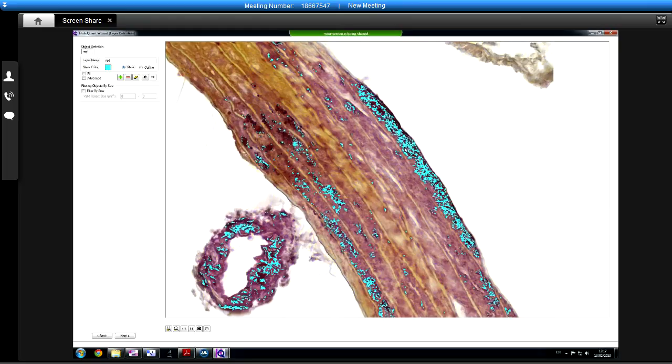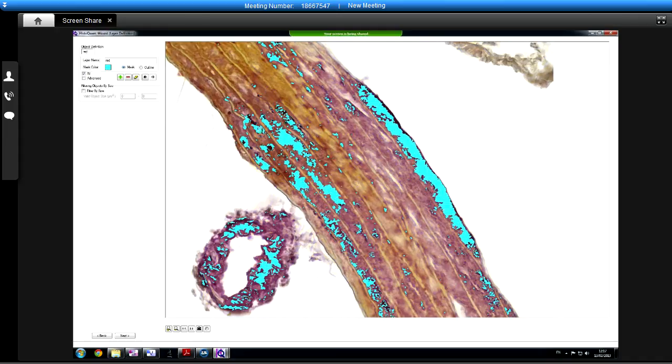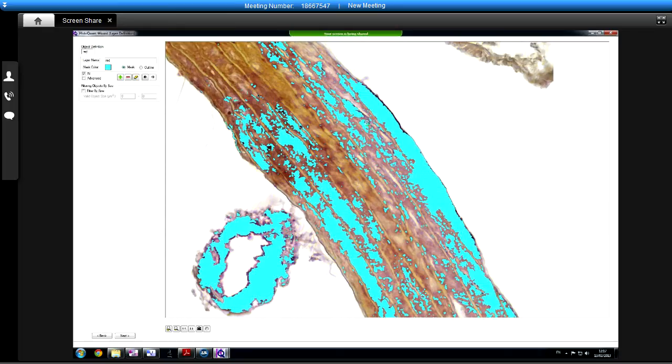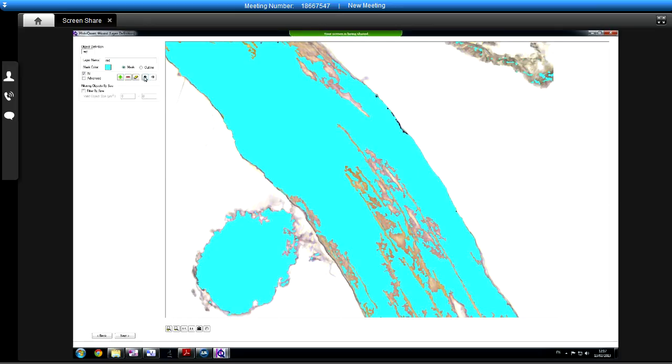That's probably a good thing, isn't it? I think, yeah. If I go mark too much, tell me. What about all this? This is all positive, yeah? And this? Yeah. Oops. Luckily we have undo.